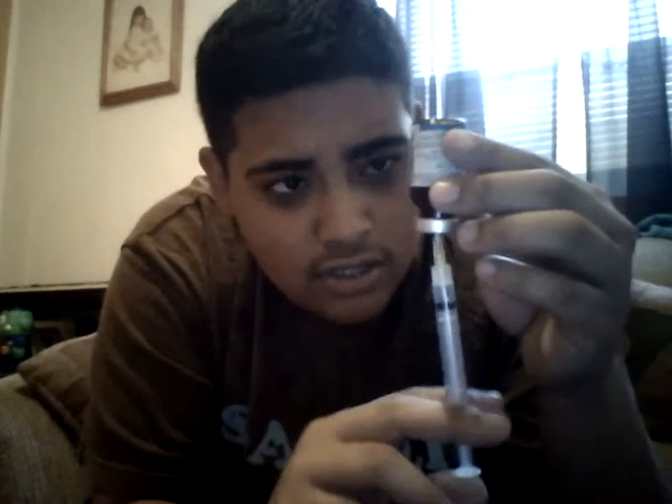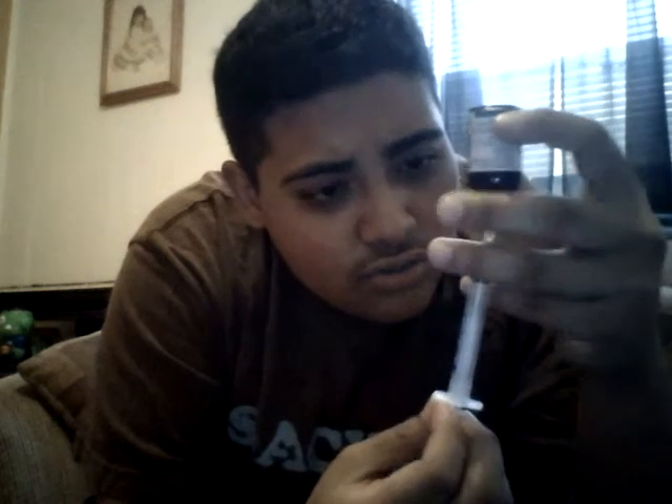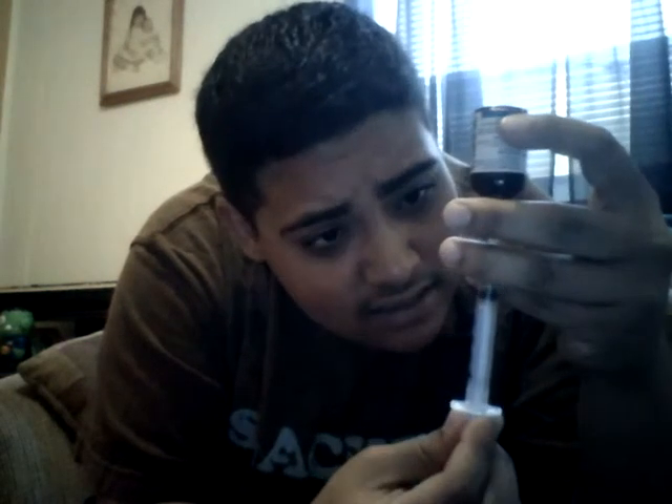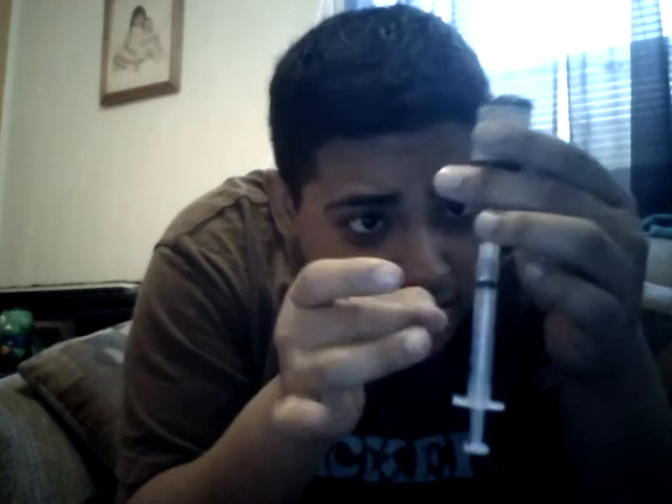I'm going to draw back some air and push it in, since this is going to be my two months on testosterone. I already have a hole in there from previous times, so I'll just put it through the same hole — you don't want to have a lot of holes in your vial. Then you put your needle in, push in the air, and begin to draw the testosterone to your dose. Make sure there's no bubbles — there's actually no bubbles in this one, so I did a pretty good job.